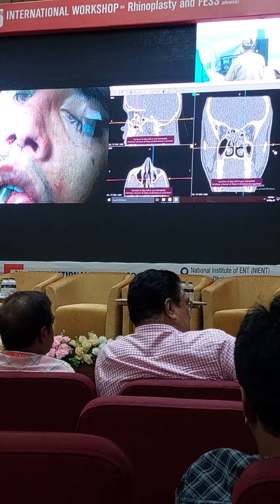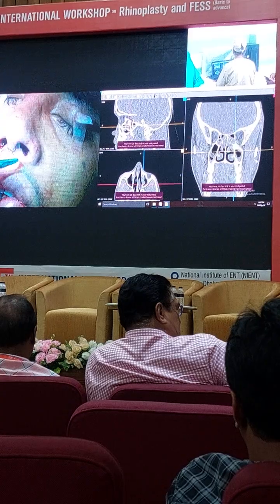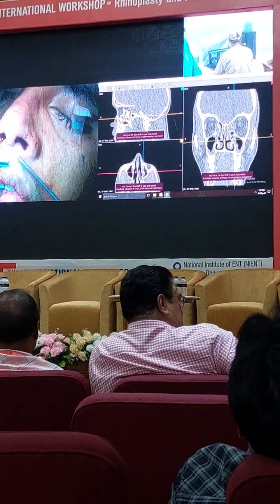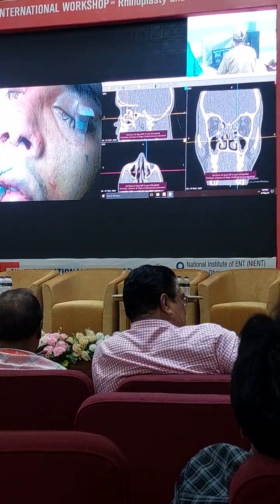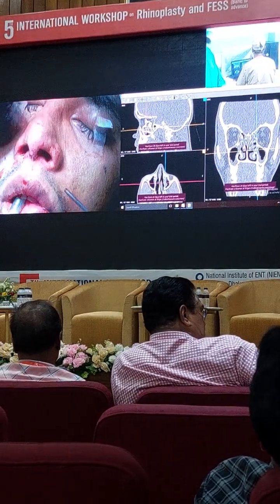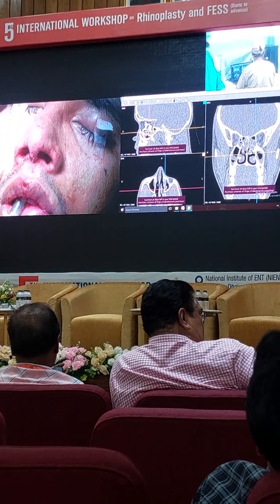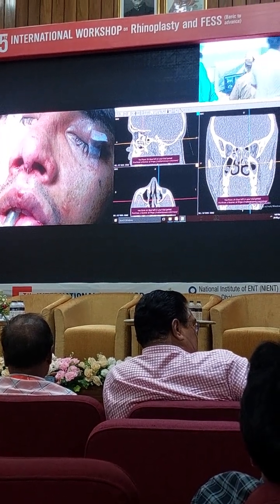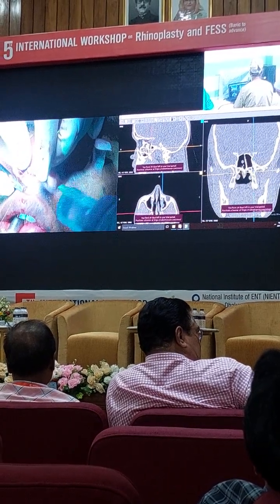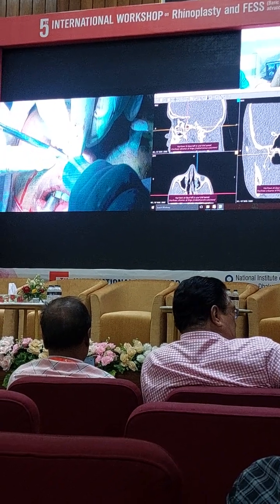Second reading, we look at pathology, and we see that all the sinuses are involved. There is no fluid level. It's more like a chronic sinusitis with soft tissue densities. So for me, this is going to be a CRS with polyposis. Okay? CRS with polyposis involving all sinuses. So we need to clear all the sinuses. Frontal too. The sphenoid is relatively clear but not fully clear.